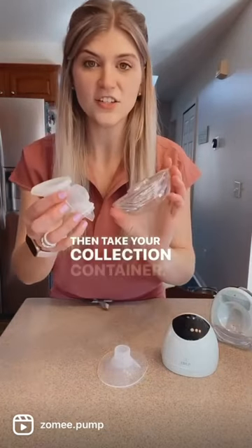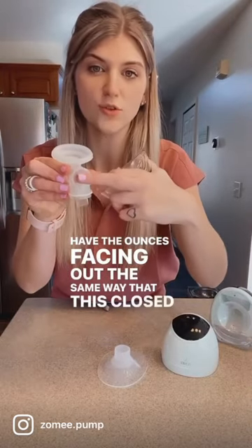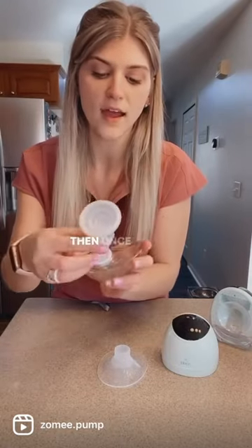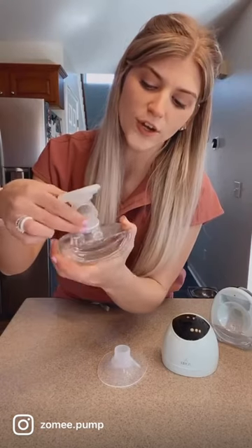Then take your collection container. Have the ounces facing out the same way that the closed part of the body is — not the open part. Then once you put that inside you can see which way to turn it.